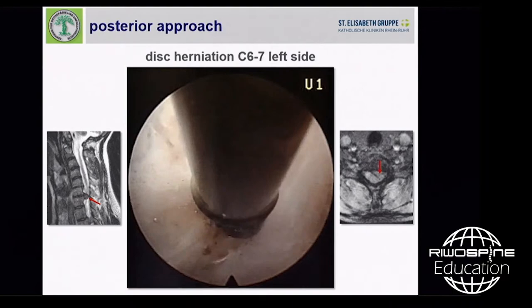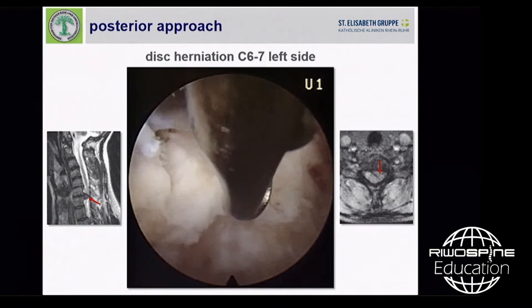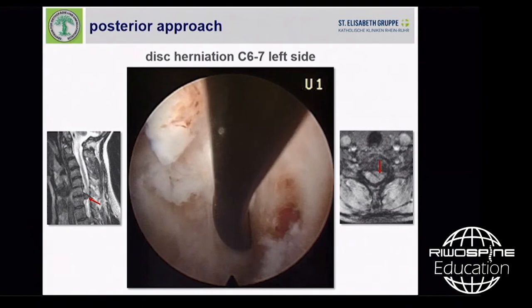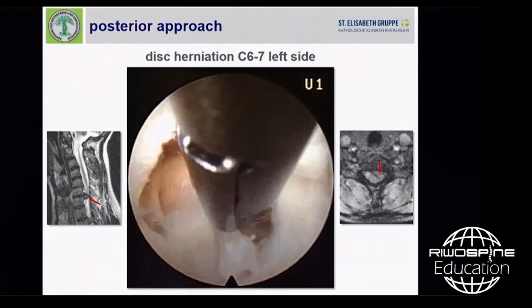Find this margin between the bony structure and the ligament. That is very important to know where you can start with your drill. And then we start to open the epidural space. Again, venous complex around the myelon. Preparation to the lateral aspect, resection of the flavum ligament until we can identify clearly the structures. Again, lateral margin of the dura of the cervical myelon and the cervical nerve.